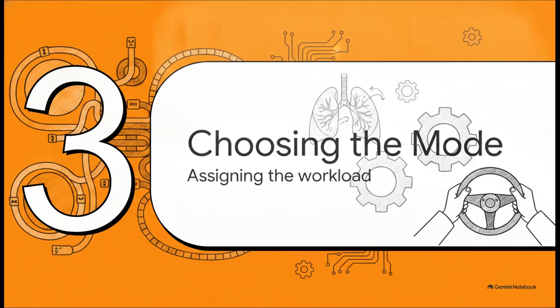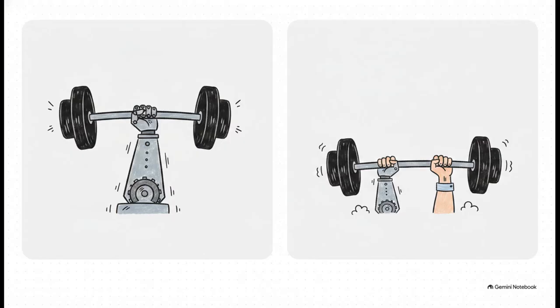Okay, part 3. This is the big one, choosing the right mode. This is all about how we divide up the workload between our patient and the machine. Let's look at the dichotomy between your 2 real heavy hitters, assist control, or AC, and SIMV. Think of AC as totally taking the wheel. It takes over the work of breathing to completely protect the patient. Picture this. It's 3 a.m., and you've just intubated an absolutely exhausted patient in severe respiratory failure. AC is your best friend right now. Every time the patient triggers a breath, the vent delivers a full, mandatory breath with a guaranteed volume or pressure.